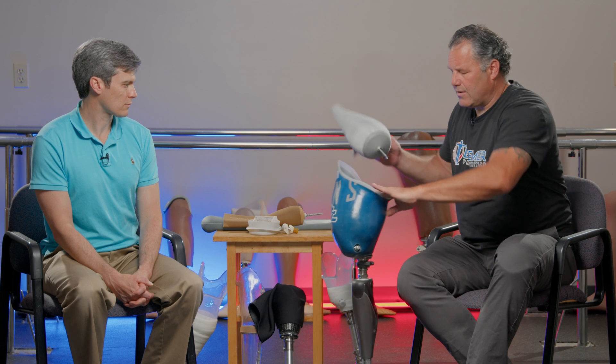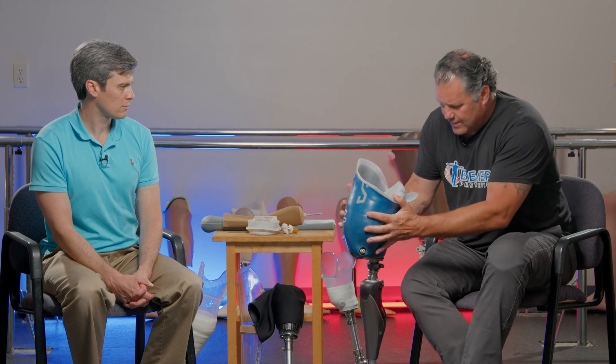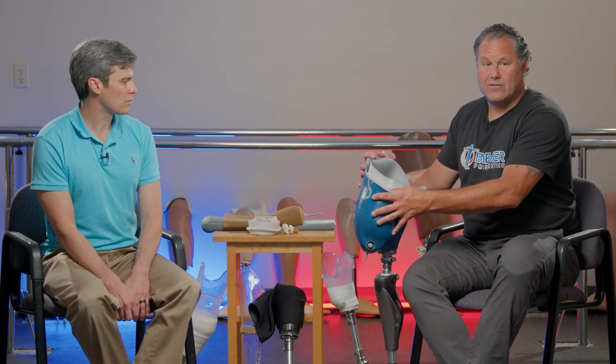Something to note when thinking about how prosthetic suspension works — in particular for transfemorals and how it differs from transtibial amputees — the longer your residual limb is, the more surface area we have to work with. For a short transtibial residual limb, you could still wear a suspension sleeve to create a seal above that area. The shorter the transfemoral limb, the less surface area available, which used to make it difficult to properly suspend the prosthesis. The gel liner really changed things, allowing people with shorter residual limbs to use normal socket designs that gave them very functional prosthetic limbs and increased their level of functional activity.